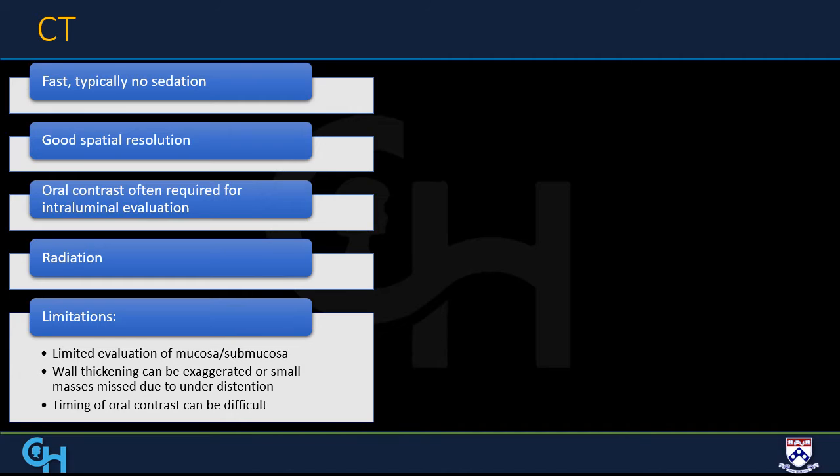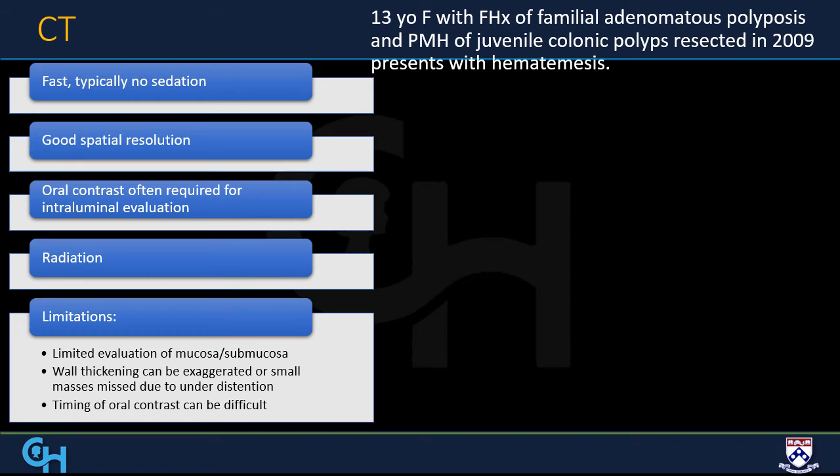Limitations with CT include a limited evaluation of the mucosa and submucosa. Also, wall thickening can be exaggerated or small masses could be missed due to underdistension. Also, timing of oral contrast can be difficult, and especially just having the patient drink the oral contrast can be limiting.